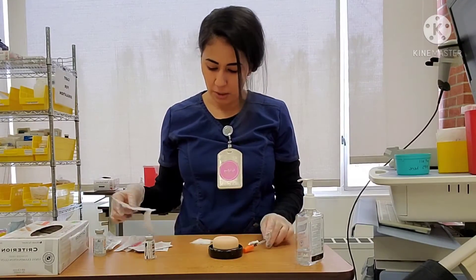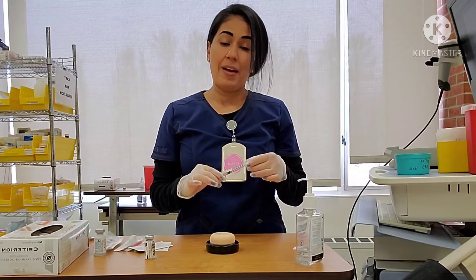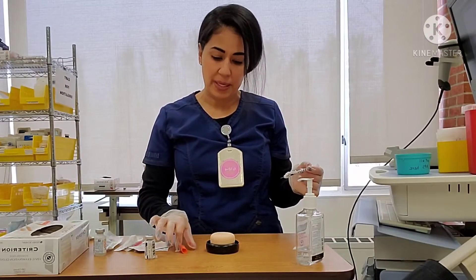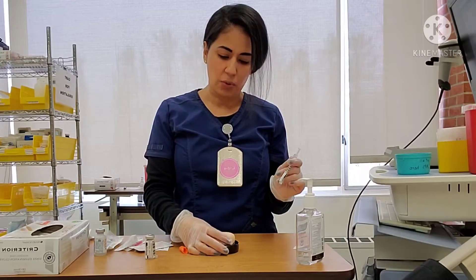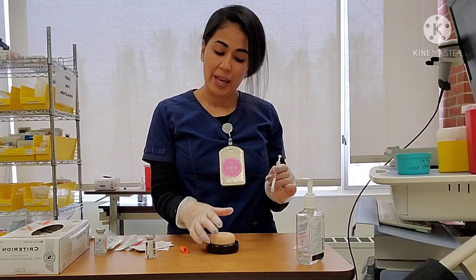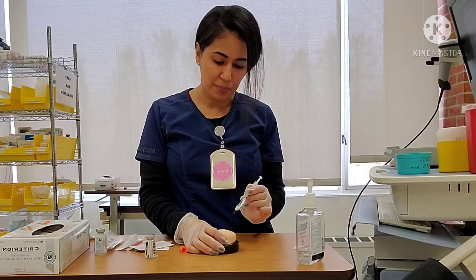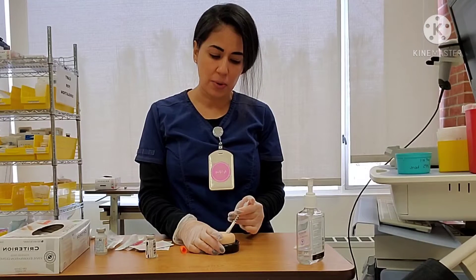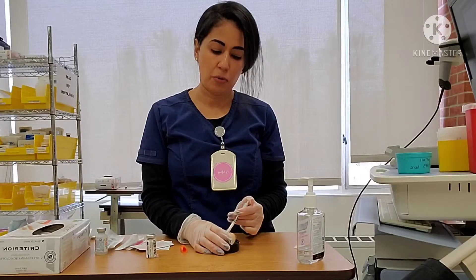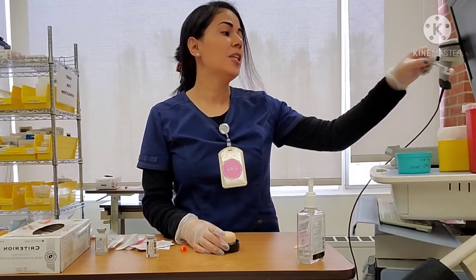I have my syringe and needle. I'm going to clean my site with alcohol. For sub-Q, you're going to go 45 to 90 degrees based on how much adipose tissue you have, and in most cases you will be pinching the skin. With the IM injection you're holding the skin taut, but with sub-Q you're pinching the skin. You're going to feel a little pinch, then dart my needle. I can release the skin and push the plunger down. If you're not too comfortable, you should be securing your syringe and needle. I'm going to withdraw it, activate my safety, and put it into the sharps.